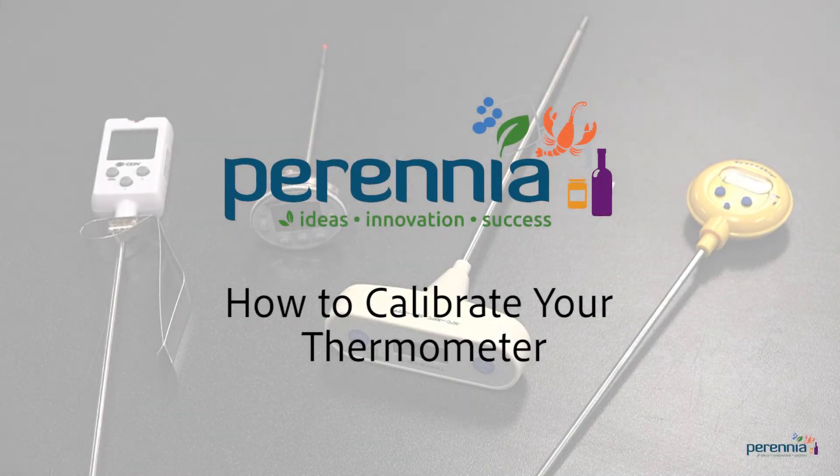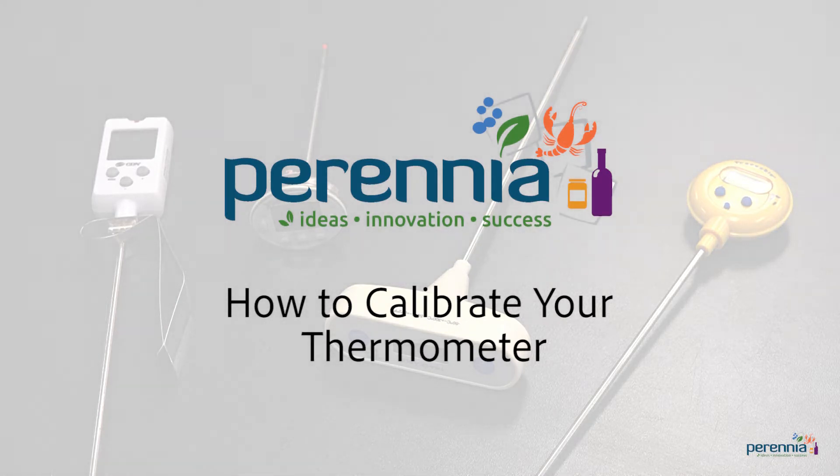Hello everyone and thanks for tuning in. Today we will demonstrate how to calibrate a thermometer using the ice water bath and hot water bath methods. You can follow this procedure for calibration or as an accuracy check.